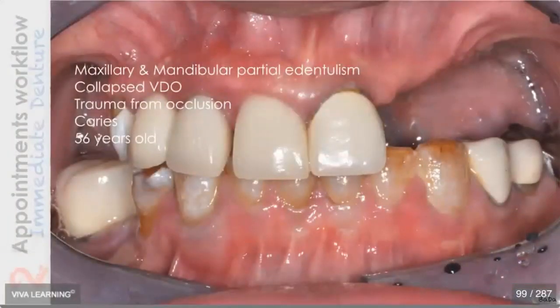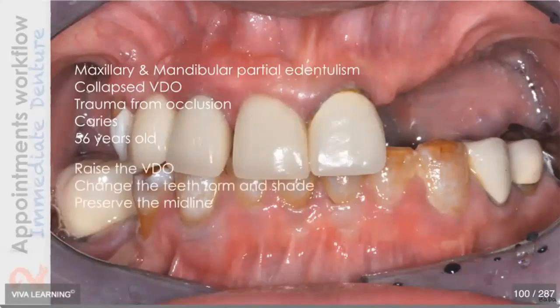This is another case. This is a single arch. You get a 56-year-old male presented with maxillary and mandibular partial edentulism. He has a collapsed vertical dimension of occlusion and trauma from occlusion on all his anterior teeth, along with some caries. So what we decided to do is extract all the maxillary teeth and deliver an ICD. Well, we needed to raise the vertical, change the tooth form and shade, but the most important thing is to preserve the midline.